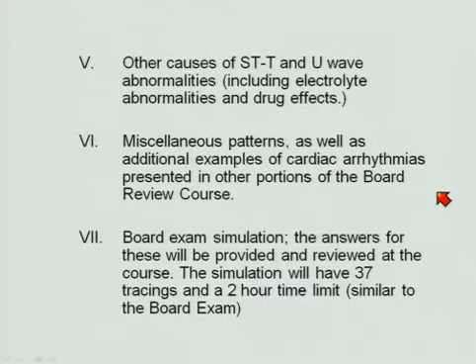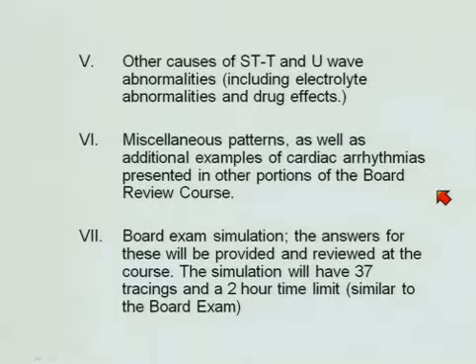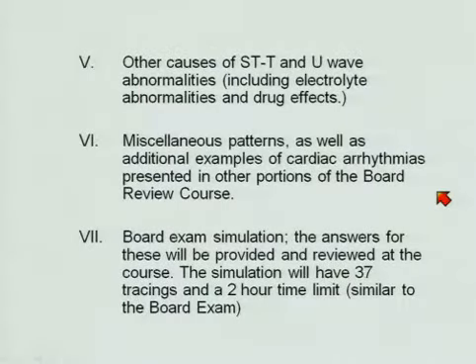The board examination, of course, is computer-based, and a tutorial for that is at their website, and obviously one would want to be very familiar with the use of electronic calipers and with their tutorial before taking the test if you are a certifier. Saturday, there will be an optional component where we'll just look at a variety of other electrocardiograms.